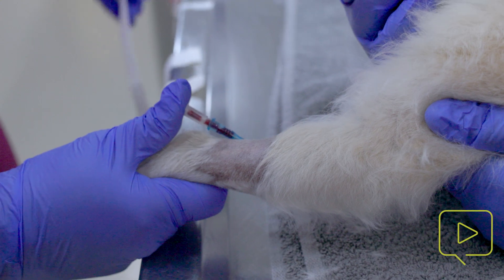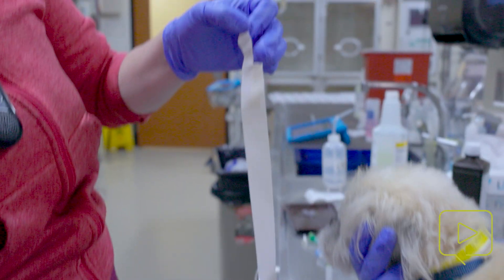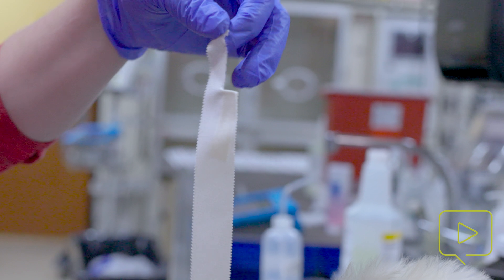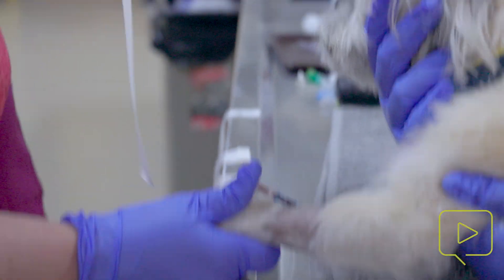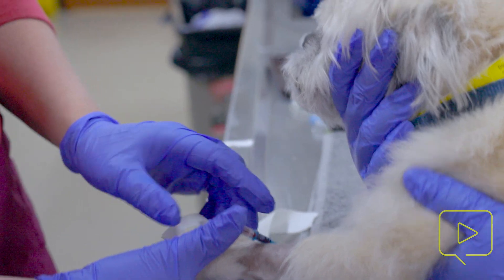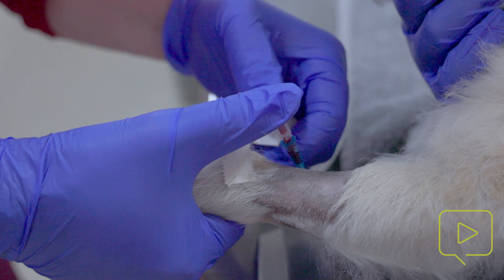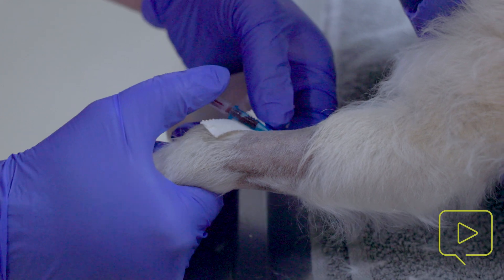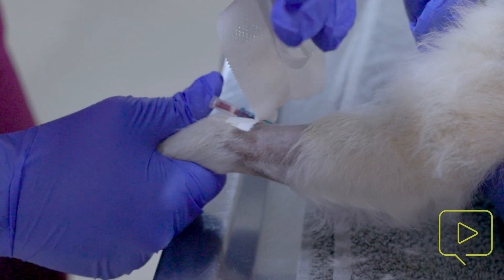So our first piece of tape: we tear down the top, tear it halfway, and then fold down one side. Left hand, keep the left hand side up; right hand, keep the right hand side up. We always like to do a little tab — it's called a courtesy tab. This will be your best friend when you have to re-tape an IV catheter. I'm going to lift up the IV catheter, place this piece underneath, sticky side up.